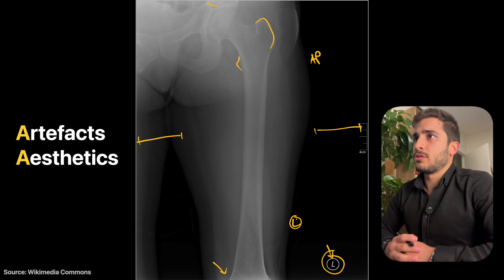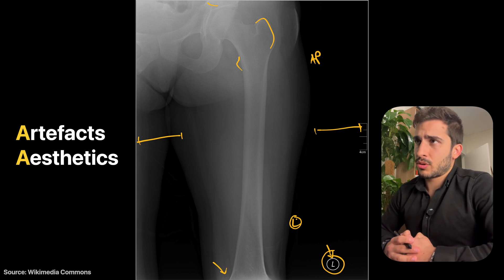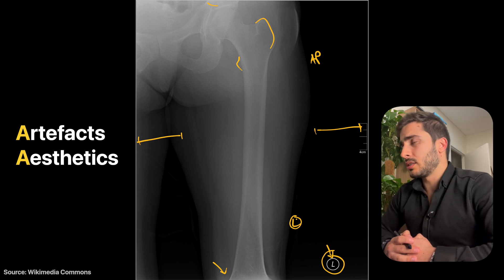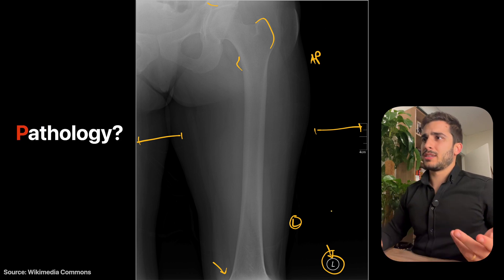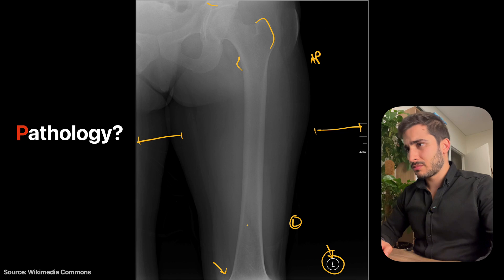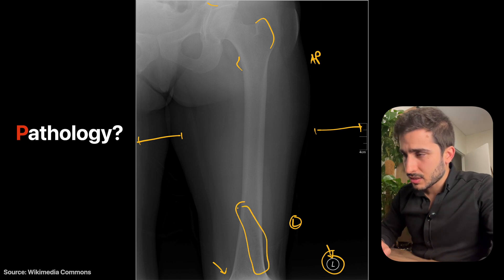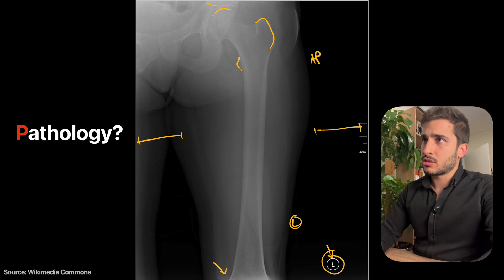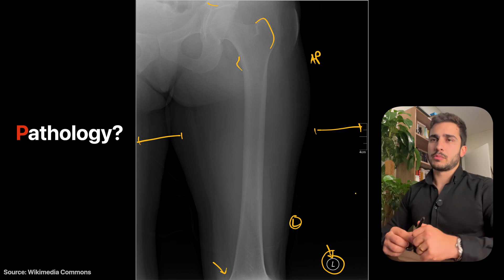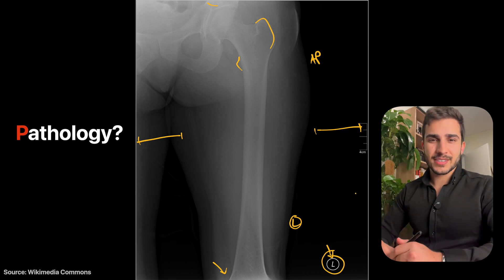Aesthetics and artifacts: no obvious artifacts, but the overall aesthetic suffers from the exposure issue. Increasing brightness, contrast and exposure in post-processing would help. No name or identification is seen for anonymous reasons. Pathology-wise, no major fractures are visible. There's a potentially suspicious area but it's hard to confirm. The joint space looks roughly okay but one area seems slightly suspicious — difficult to determine from this x-ray alone.